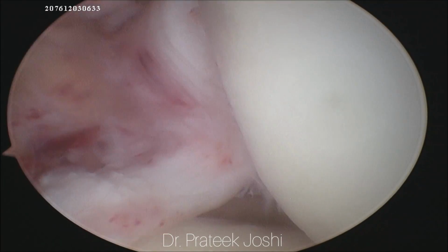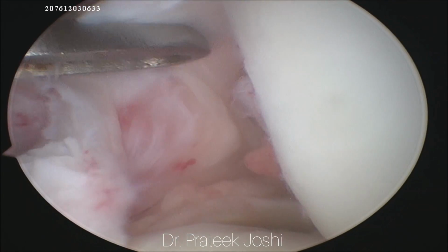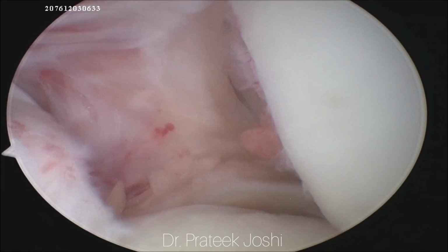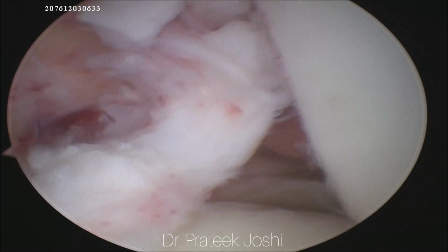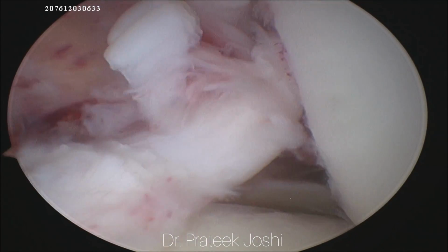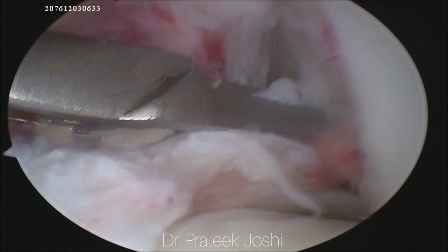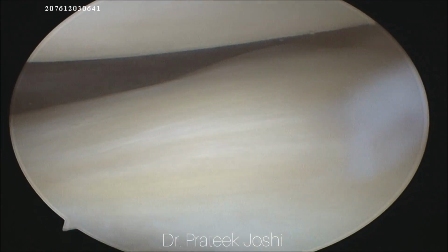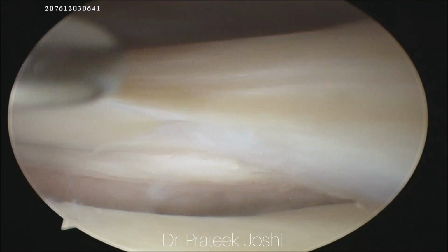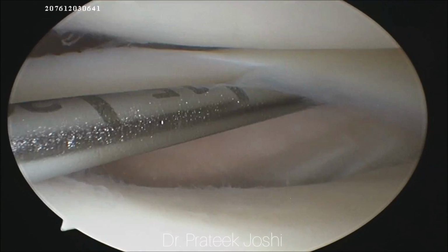What you are seeing right now is the view of the intercondylar notch as seen through the anterolateral portal. You can clearly make out that the anterior cruciate ligament is completely torn, and now we are trying to identify the ACL footprint. Now as we go in the lateral compartment, you can clearly make out that there is a tear involving the posterior horn of the lateral meniscus.